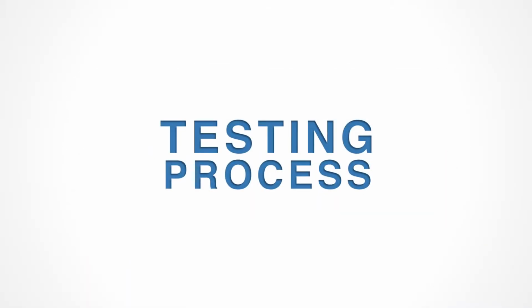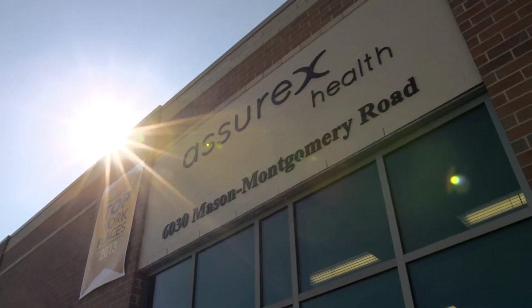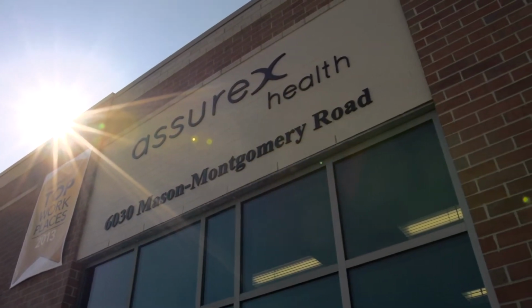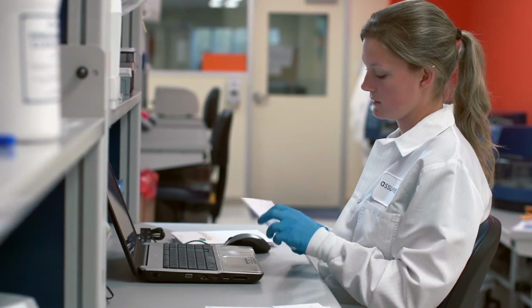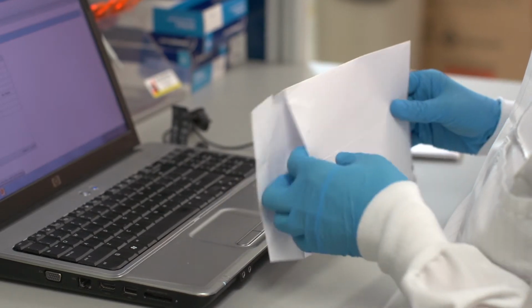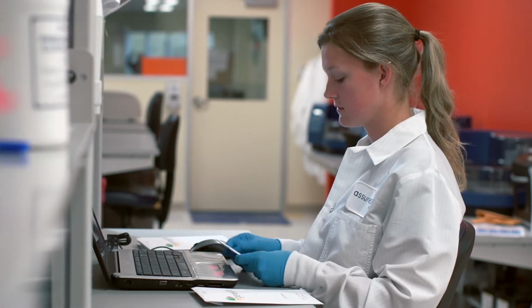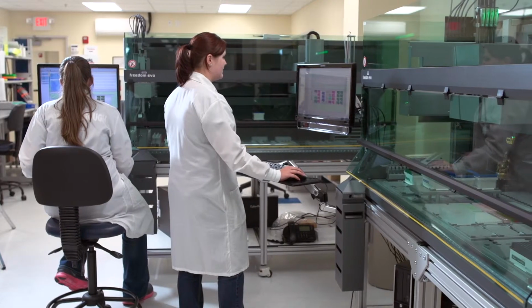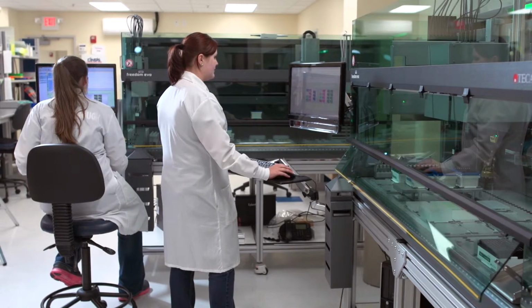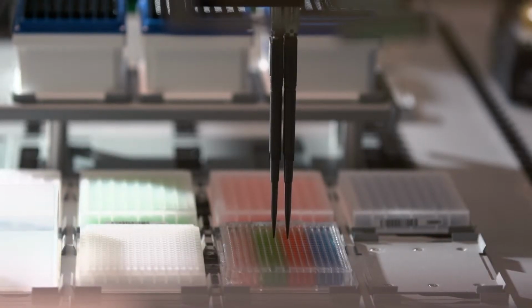The testing process. After we receive the FedEx envelope at our CLIA and CAP accredited AssureX Health Laboratory, we match the order number and patient information to the information submitted in the web portal. If we have all of the required documents, we verify that the chain of custody has not been broken and begin the genetic testing.